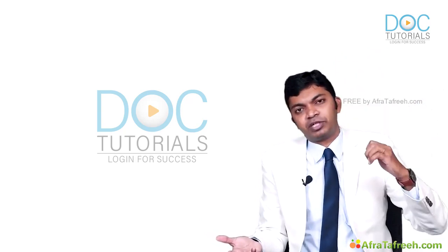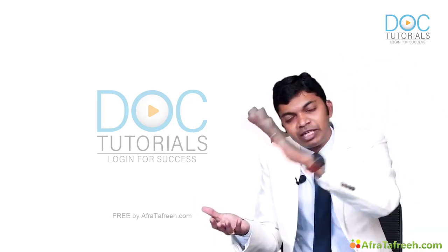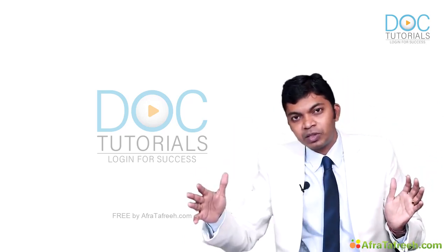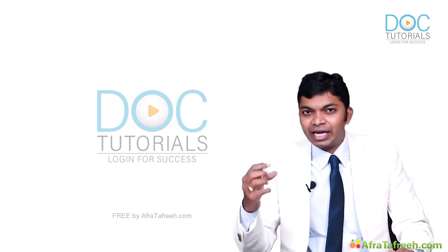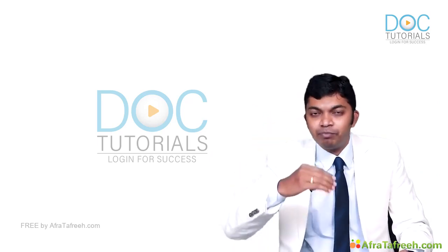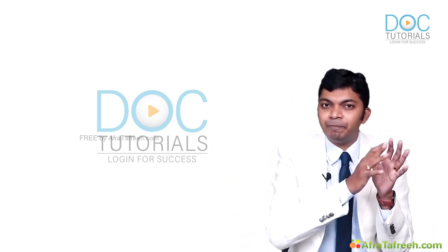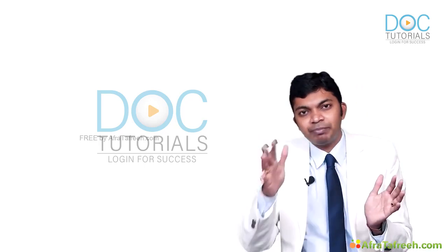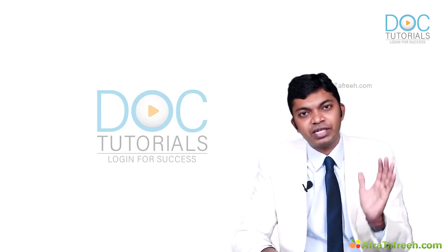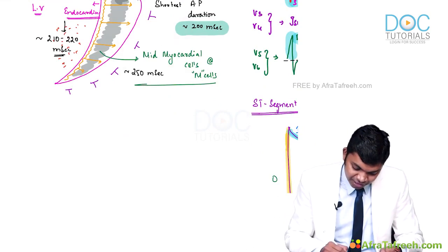Current from endocardium and myocardium starts flowing towards epicardium. As current is traveling towards any active electrode, you know very well, you will have a positive deflection in your ECG. In this case, as current is moving from endocardium and myocardium towards epicardium, in another way, towards the active electrode, you will have the first upstroke of the T wave, doctors.